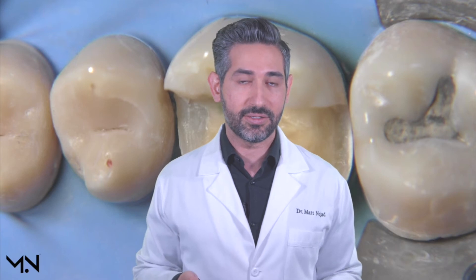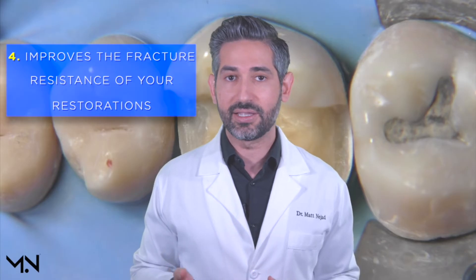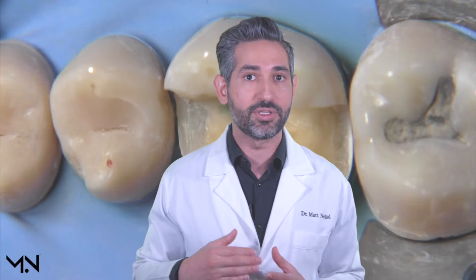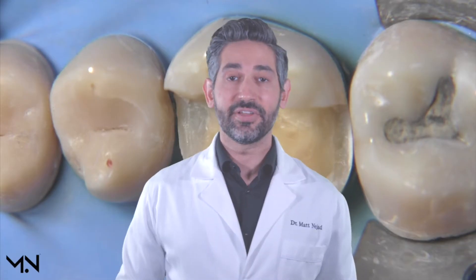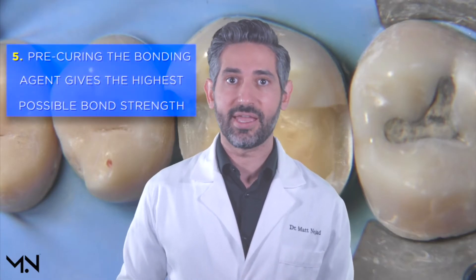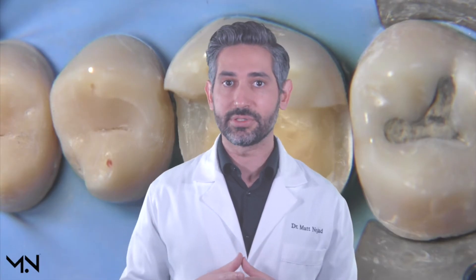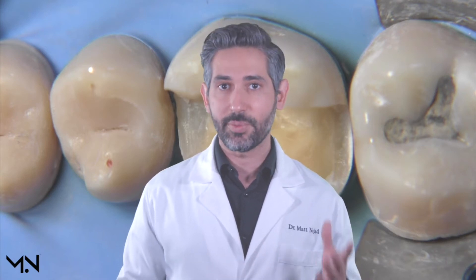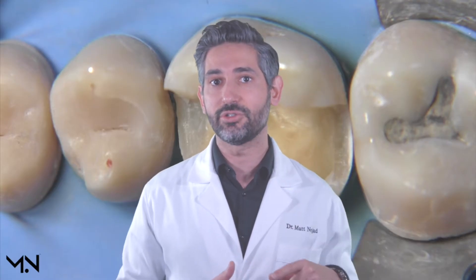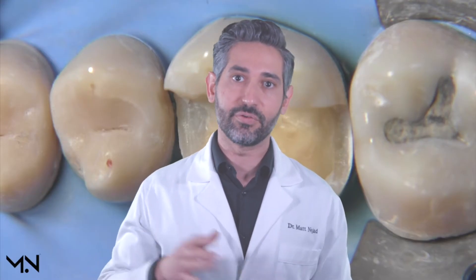Another advantage is that immediate dentin sealing improves the fracture resistance of our restorations — you're not only getting a stronger bond but also improving the performance of your restorative material. Additionally, pre-curing your dentin bonding agent gives you the highest possible bond strength. When you do traditional cementation, you're trying to combine steps together, but studies have shown that when you pre-cure the adhesive separately, you get the highest possible bond strength, and you avoid the issue of adhesive thickness preventing full seating of your restoration.